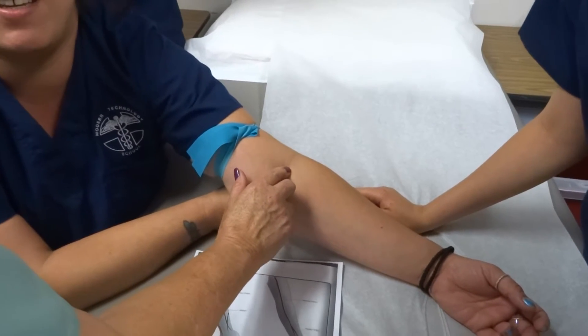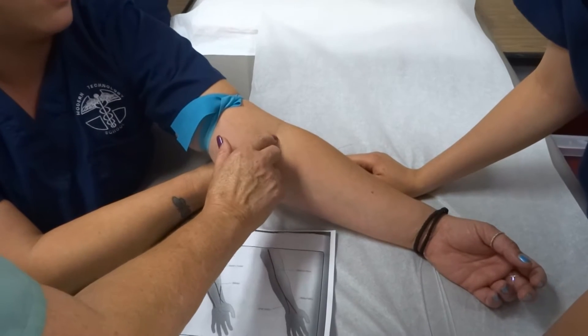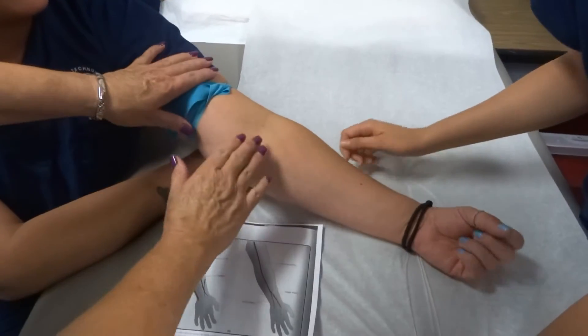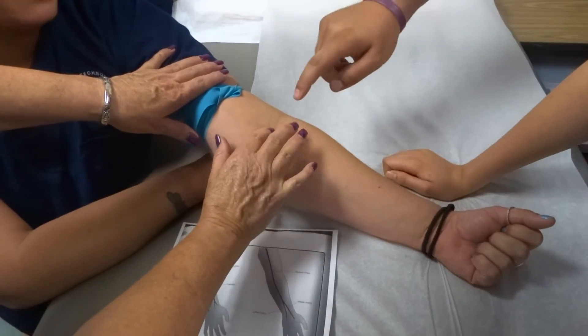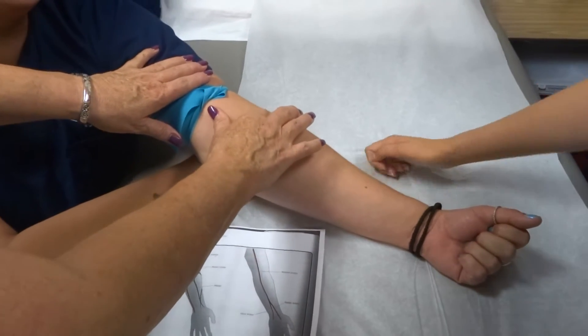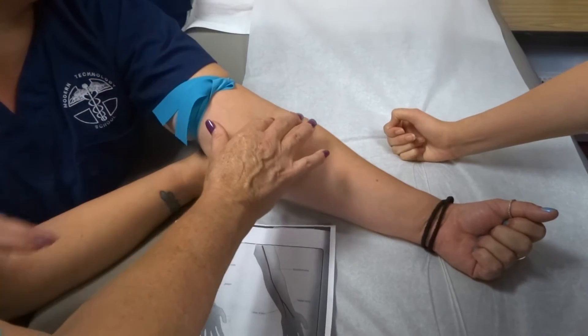I can't even touch my own veins — I get weird. Make a fist for me, please. Look at that, right there. They don't want to come out. They're not that guy. Are you kidding? It's so little. I know. You gotta do a butterfly with that thing — I wouldn't even waste my time on it.